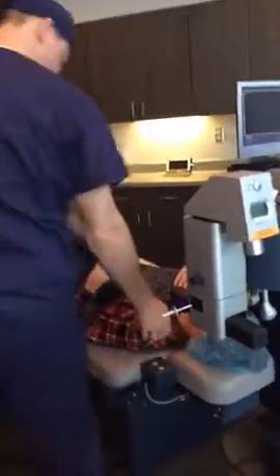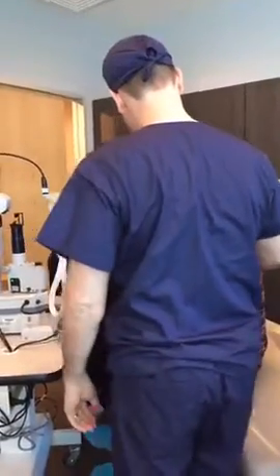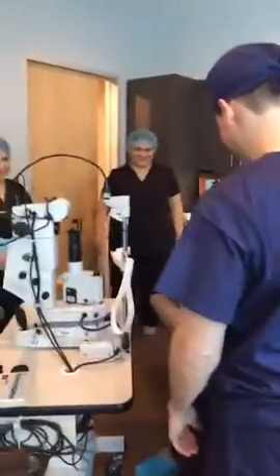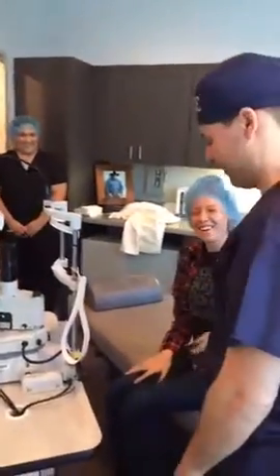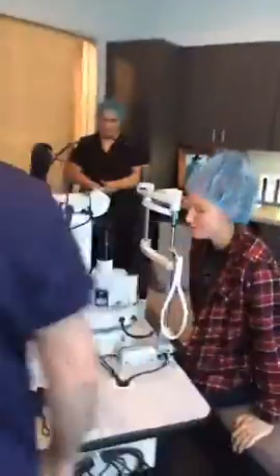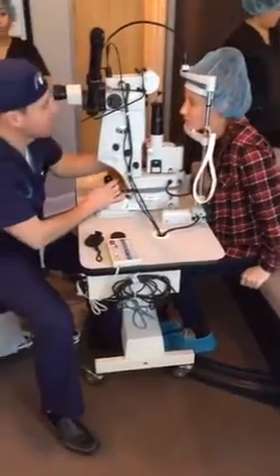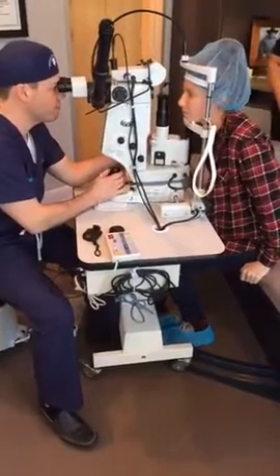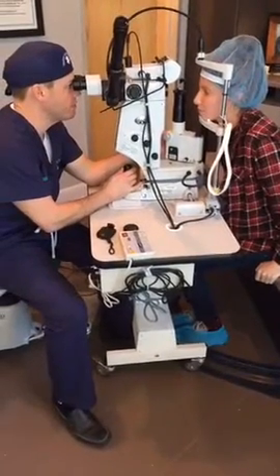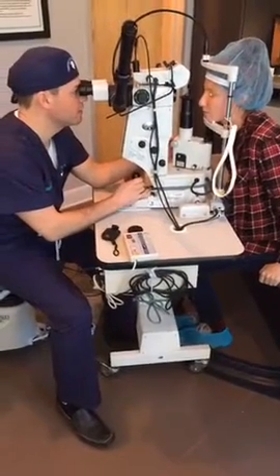Go ahead and sit up now. Just kind of swing your legs over to the left. So, feel okay? I do. I feel a little loopy right now. A little loopy? Okay. All right, good. I'm going to have you go ahead and place your chin right over there. Okay. And with the straight head, please. Just blink a couple times. That looks perfect. Blink again.